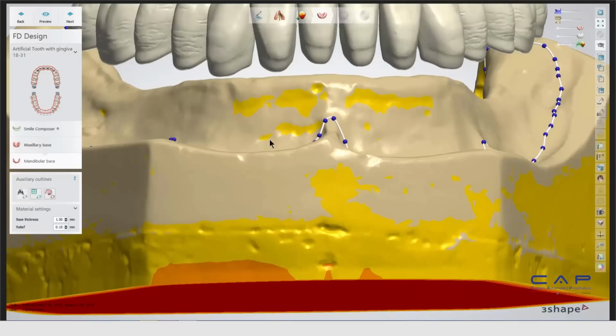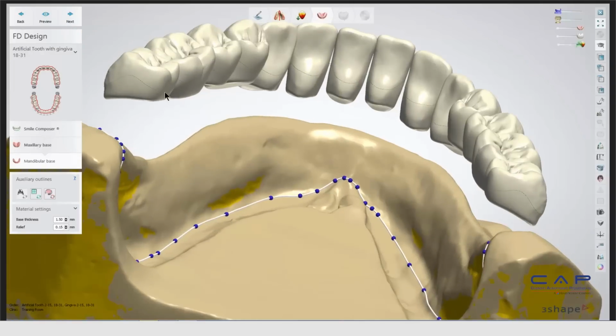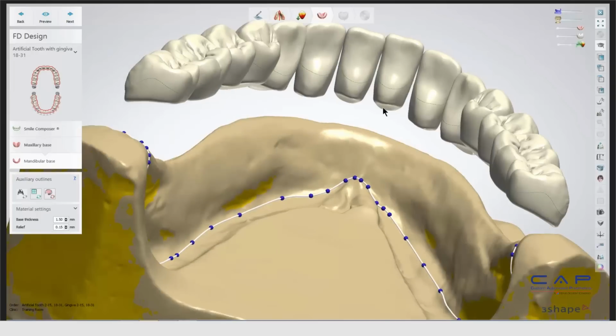Do the same to the lower. So now we're just going to do the same to the lower. And here's what I was just telling you about, that green line that we see here. So the tissue is going to go all the way up to that green line. Whereas if you've ever had to design the gingiva on an ISO bridge, you have to manually sculpt that area. It can be a little bit tedious.